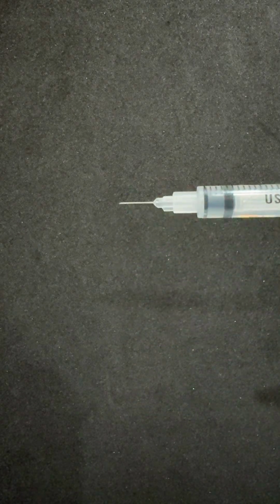So let's look at some other ones. Here's another one. This one is super short. This is 5/16 of an inch. It's very thin. A lot of times your patients don't really even have much pain when you're giving these injections. They might not even feel it because these needles are so tiny. Let me show you another one we got. And here's another one like on our insulin.